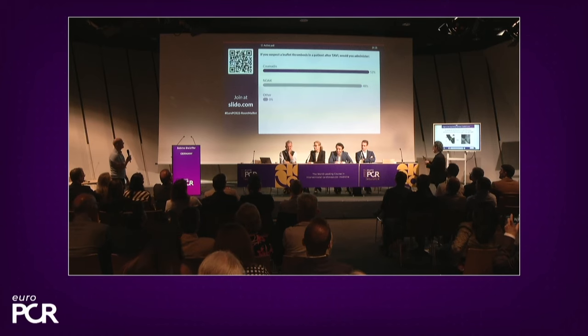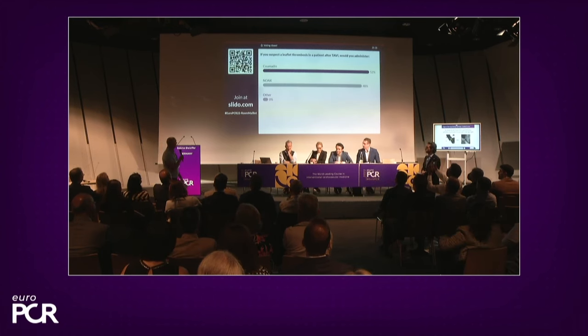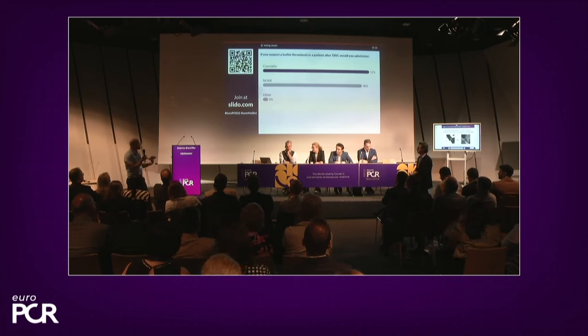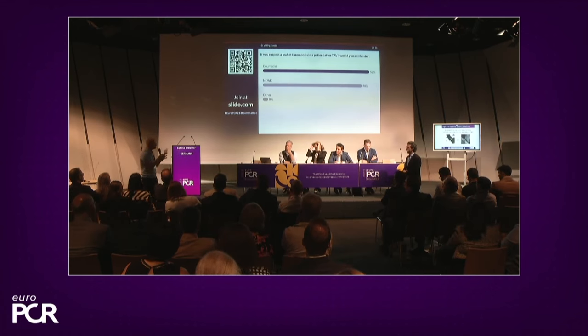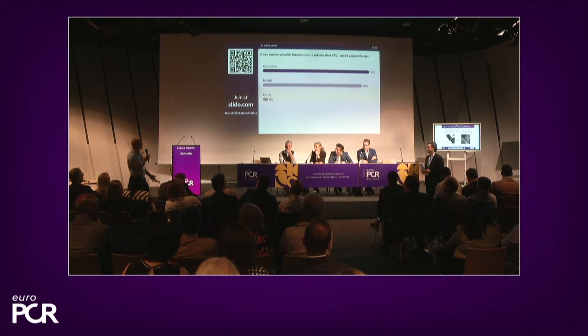50-50, interesting. Well, obviously, antiplatelets do not work in the context of leaflet thickening and leaflet thrombosis. So obviously, that message already got through the community, and rightfully so. I still am in doubt whether this leaflet thickening by itself is clinically relevant. Obviously, when it has an impact on gradients and you see a change in gradients occurring from early discharge to a couple of months later, okay, that would really trigger me. But otherwise, I don't know.